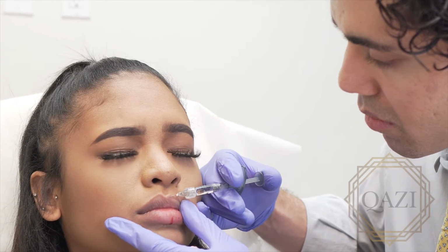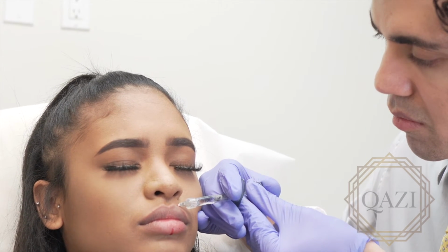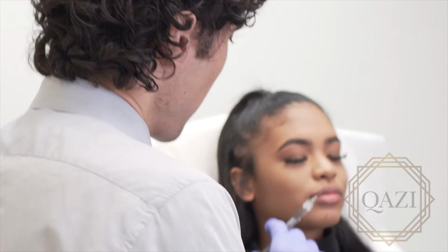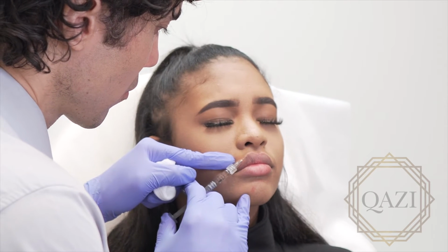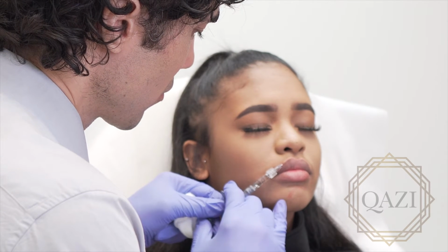As you get along to the cupid's bow, it is quite painful over here, so just bear that in mind. Try to be as gentle as possible. I still do a retrograde manner for each one of these spots. Of course, you really do want to measure it so that you don't have to do excessive poking, particularly in this very sensitive area.